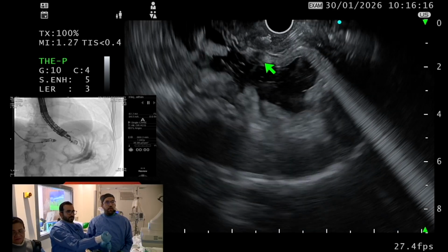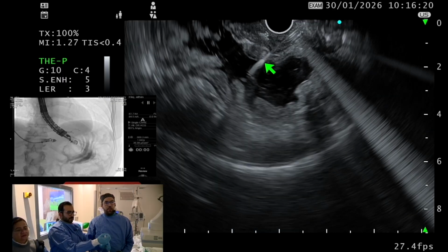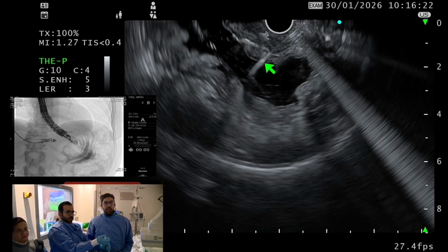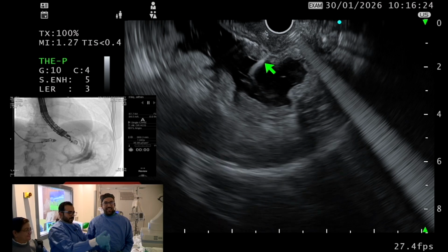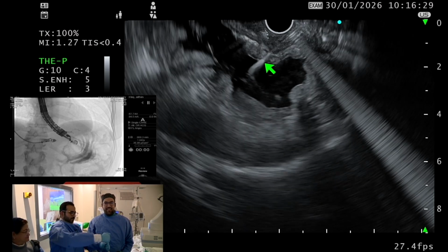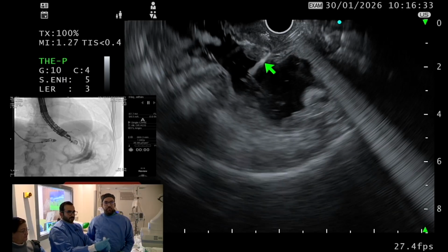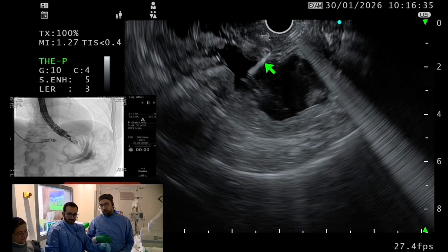If I don't have Nawaf and Adel in my hospital, our laparoscopic team are very good. What they do is put you in the biliary tree, and then they say, do the rest. Is that easier than doing it in a small pouch?